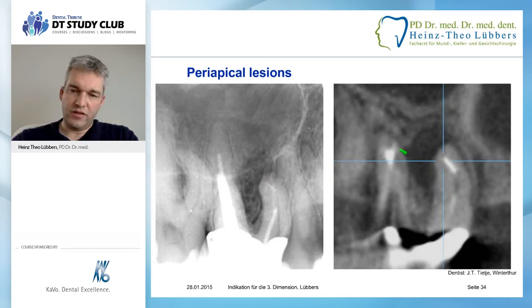It's another sagittal view of the same situation, and you can clearly see the periapical lesion, which you can suppose that there is one here, but you cannot be sure, and you're definitely not sure about the extent and whether the second root is affected or not, and all those details you might need to know. By the way, this fractured instrument by itself here would, by clinical rules or by guidelines, be an indication for root resection.